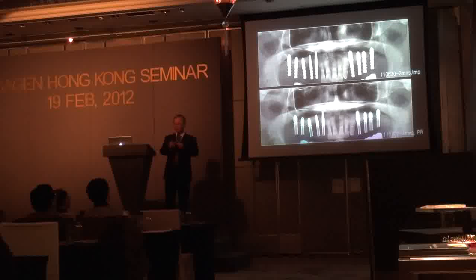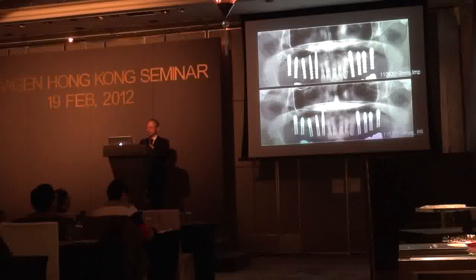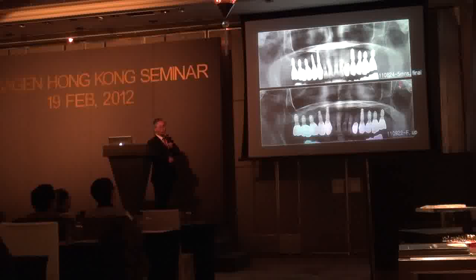Yes, because the 4 by 10 millimeter surface area was engaged with healthy bone. So why not take impressions after 3 months? And I delivered the temporary at 4 months, and at 5 months finished the whole case and the follow-up.